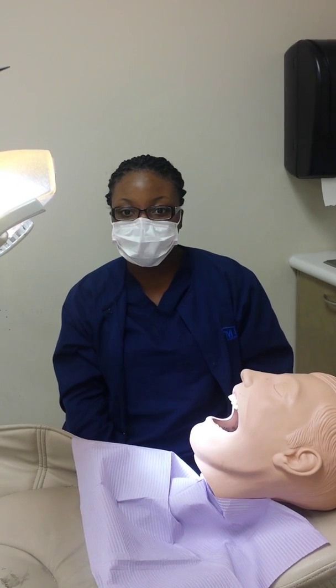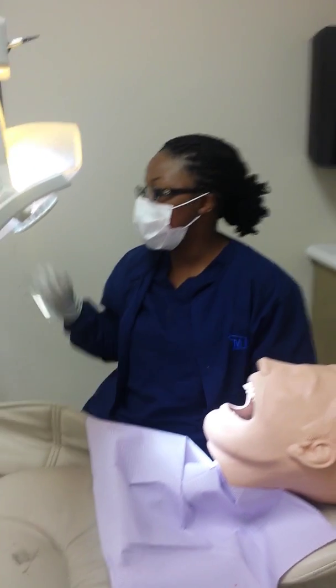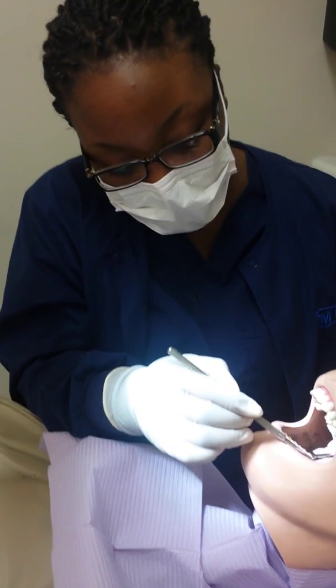Hi, I'm Arlisha Carr and I'm doing my project on Coronal Polishing on Dexter. The first thing you would need to do is get your mouth mirror to look for any restorations that Dexter might have.